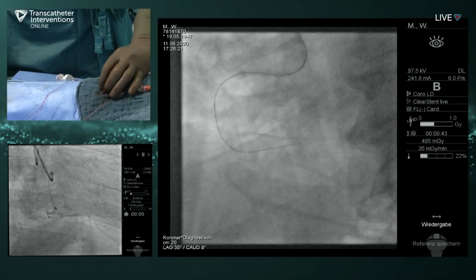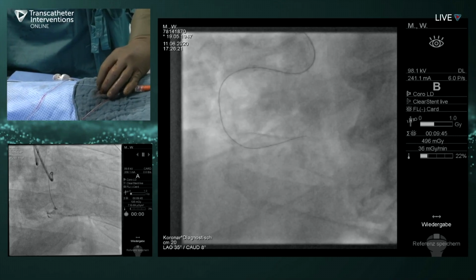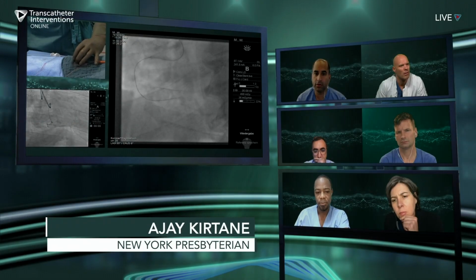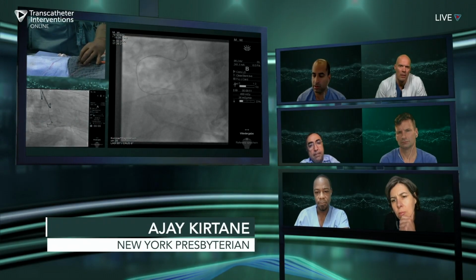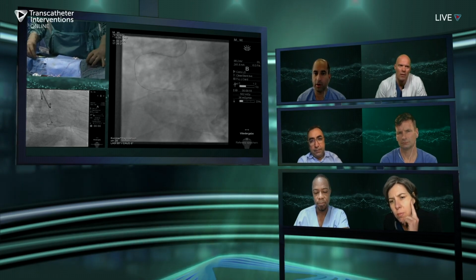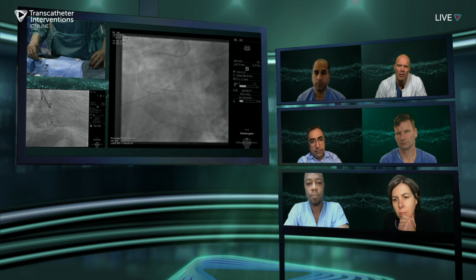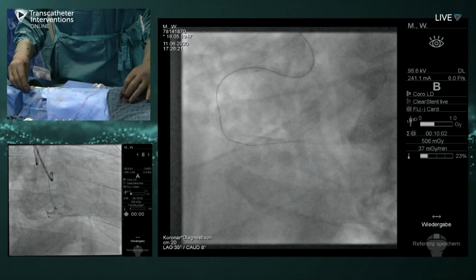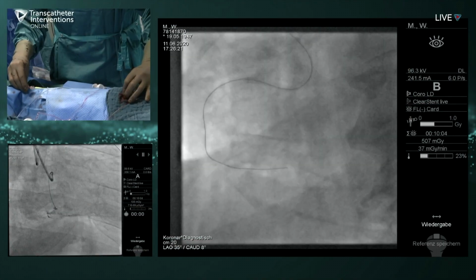Now, you have to be cautious about doing that if you're with a stiff wire, but in this case, the likelihood is that it's in the subintimal space, in which case it's okay. But the de-escalation is important because otherwise that's how you end up in the pericardium or somewhere else. Correct. So I don't mind just going to the push imaging view. Yeah, that's great.